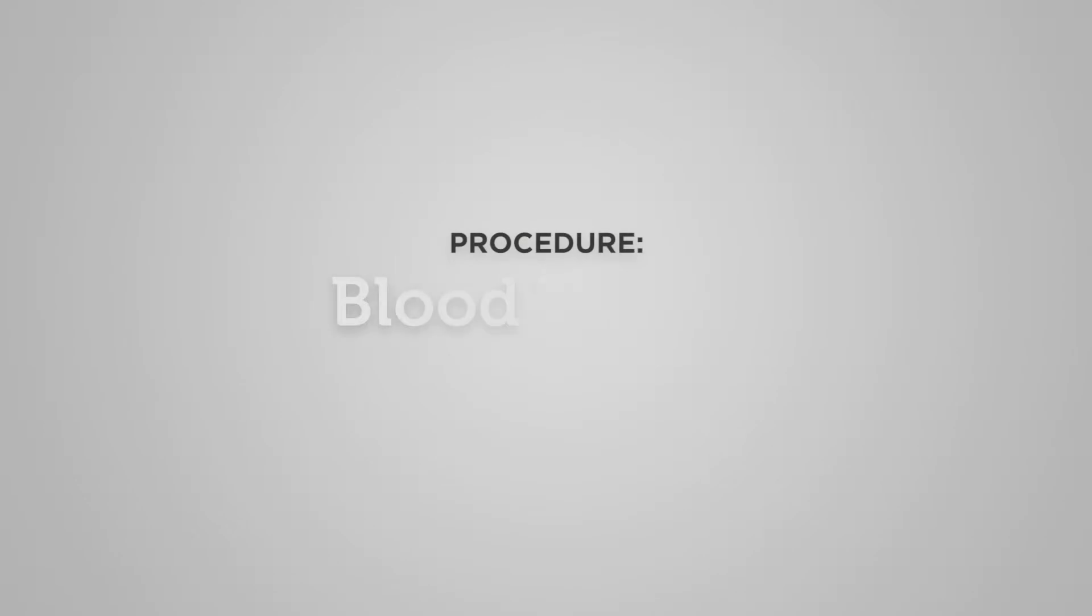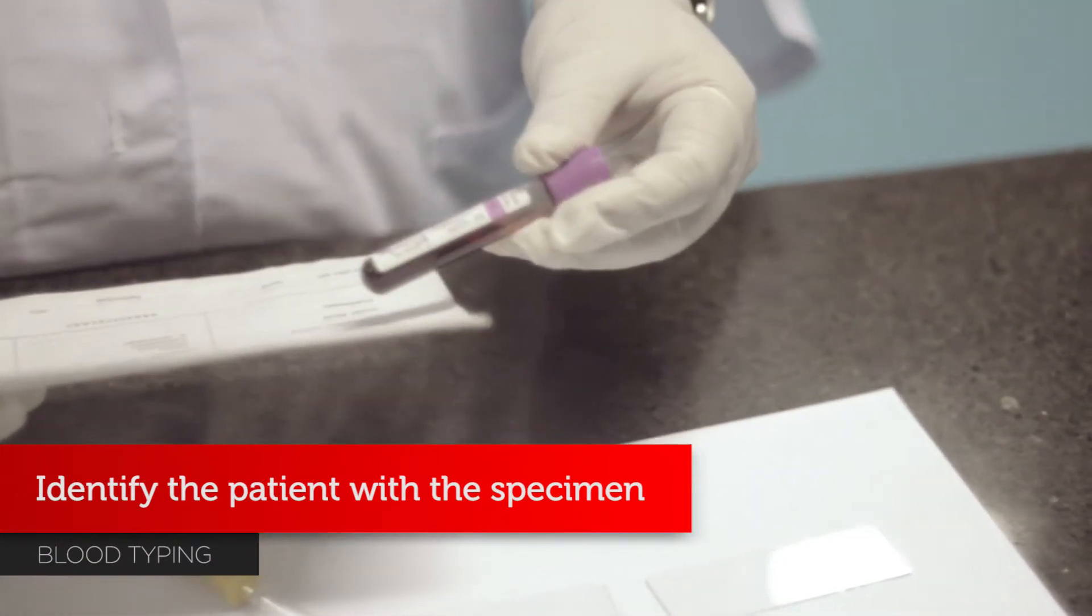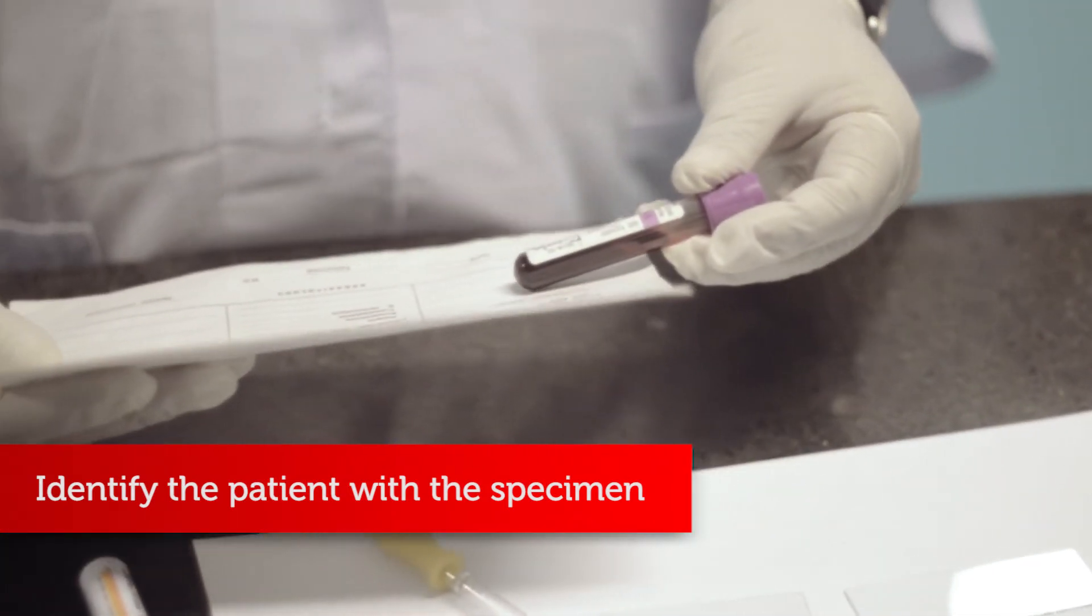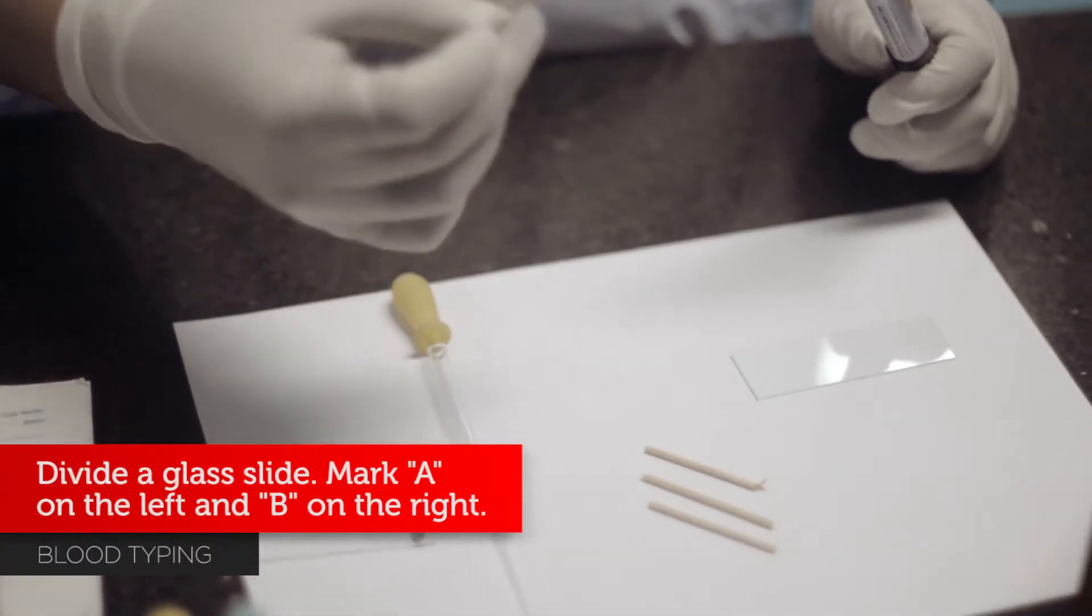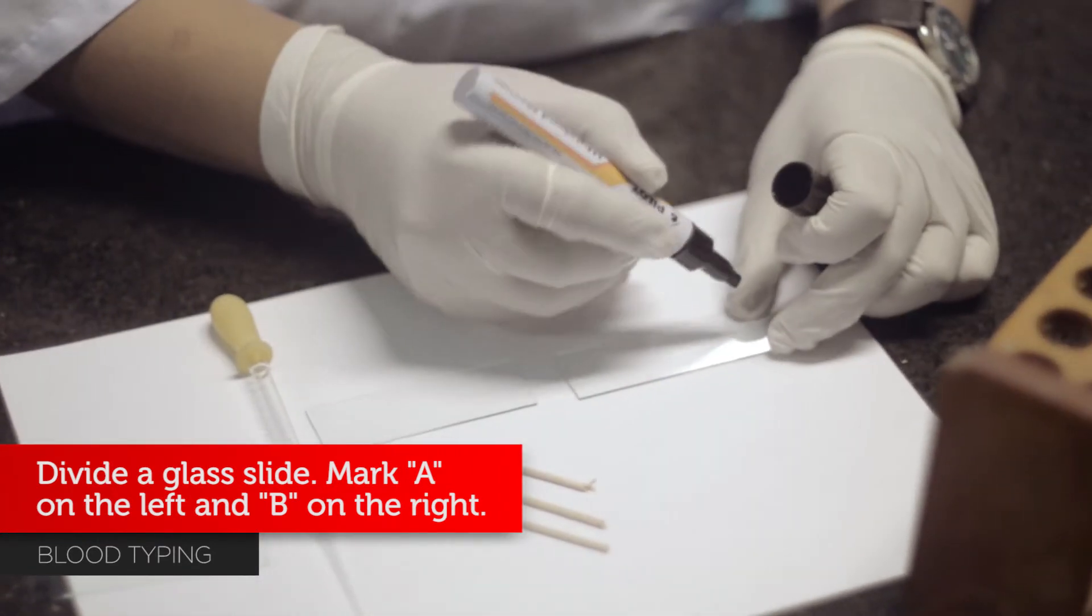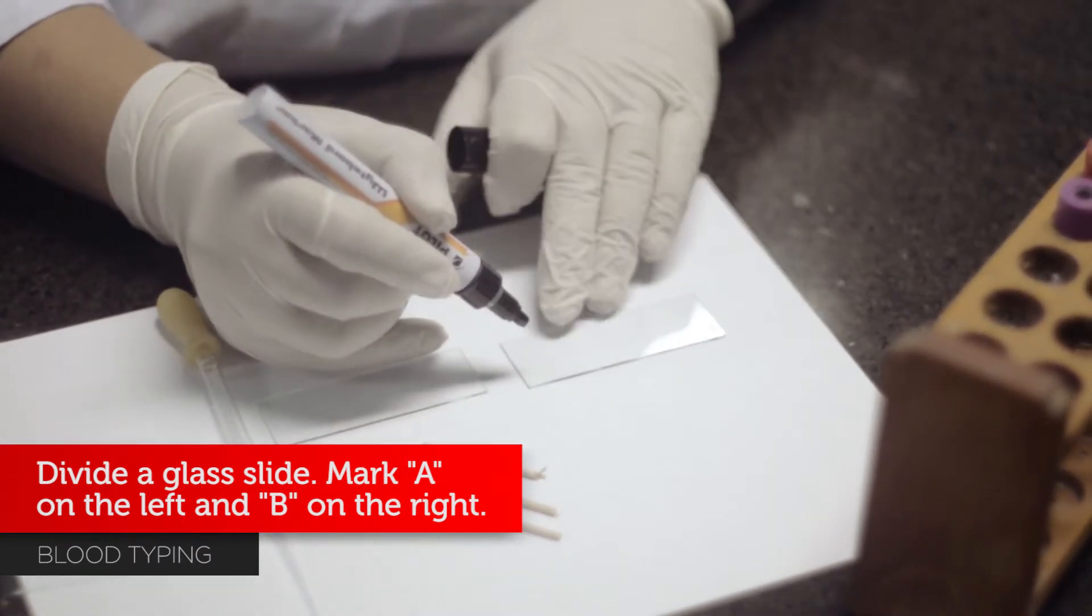Procedures for blood typing: Identify the patient with the specimen. Divide a glass slide by marking through the center. Mark A on the left and B on the right.